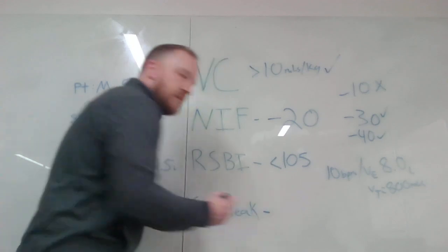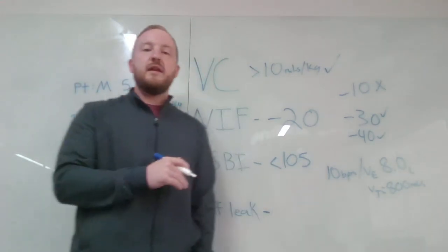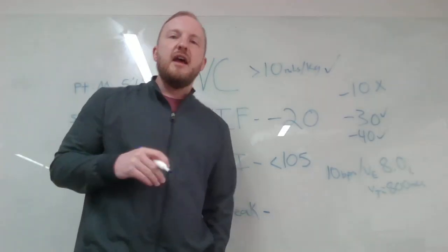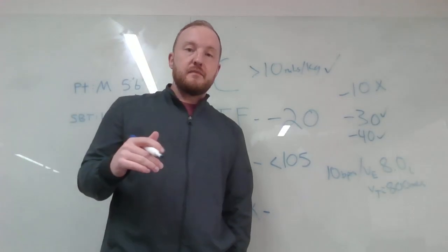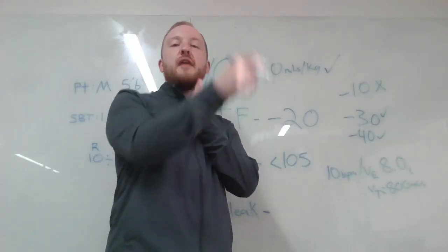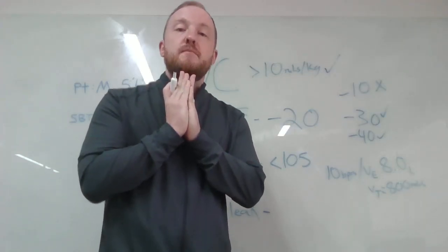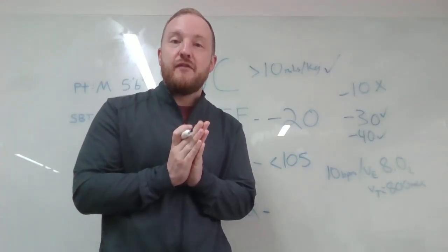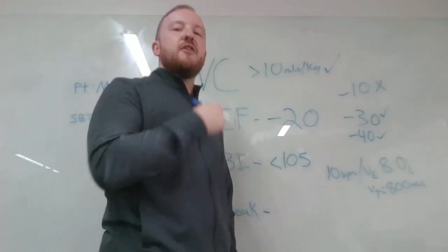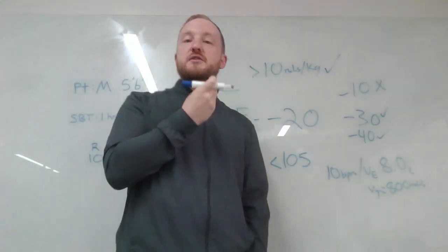All right, last one here. Your exams might say it has an audible cuff leak. What do we know about a cuff leak? A cuff leak is going to tell us about upper airway swelling. If there is no cuff leak, that means that patient's airway is swollen around the tube. If you pull that out, there's a risk of that airway swelling continuing and narrowing that airway, making your next intubation far more emergent than it needs to be. So with a cuff leak, we want to hear that air coming out and around that tube, so we know that the airway is not swollen around there.